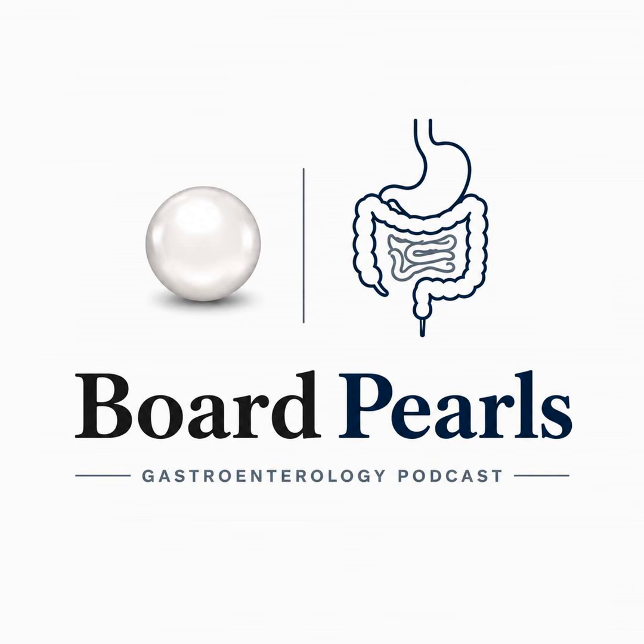A bright mass in the submucosa, the 3rd layer, is a lipoma, fat reflecting brightly, typically incidental and benign, and usually diagnosed by appearance alone. A black, echo-free mass in the 3rd layer is a duplication cyst, anechoic because it is fluid with no internal interfaces to reflect sound. A neuroendocrine tumor sits in the 2nd or 3rd layer and reads dark. A granular cell tumor is typically dark in the 3rd layer. Pancreatic rest is heterogeneous and often crosses several layers, which is itself the clue.